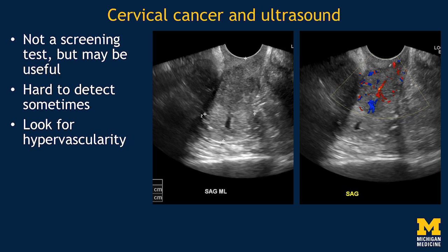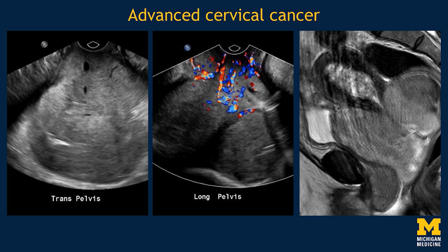Cervical cancer and ultrasound: ultrasound is not a screening test for cervical cancer, and it may be very hard to detect, but we sometimes do. One of the ways we can detect it is to look for hypervascularity. Here's an example of an older woman who had abnormal vaginal bleeding and was noted on transvaginal imaging to have a hypoechoic mass. More striking is the vascularity of this mass. I've seen a number of cervical cancers missed at ultrasound, but in retrospect, if you look back at the Doppler images, there's almost always hypervascularity in the area of that tumor. So think about that pearl when you're looking at pelvic ultrasound.